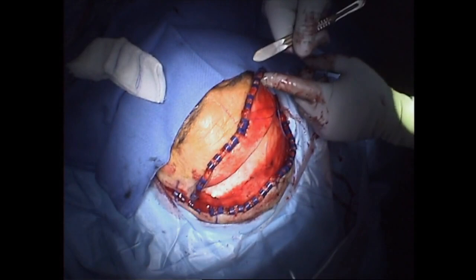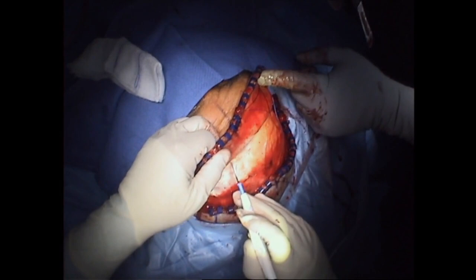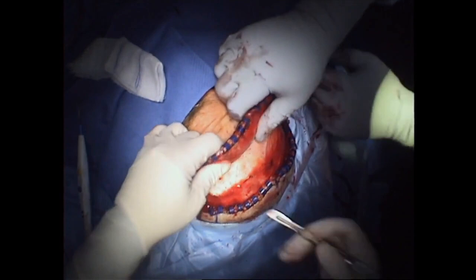Here is my neurosurgery partner, Dr. Van Gumpel, beginning with a bifrontal craniotomy. You can see a bicoronal incision being carried out and the scalp flap being raised.